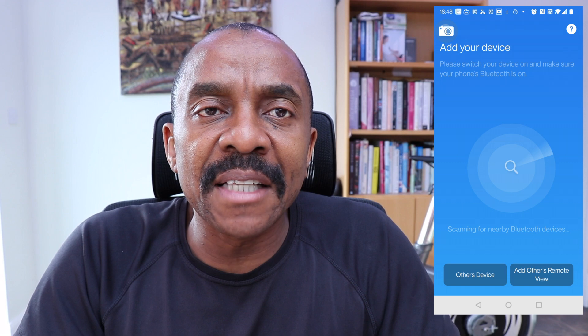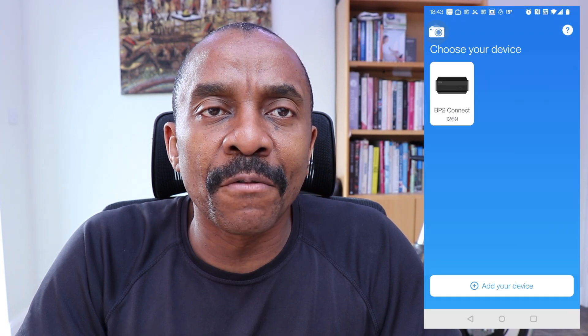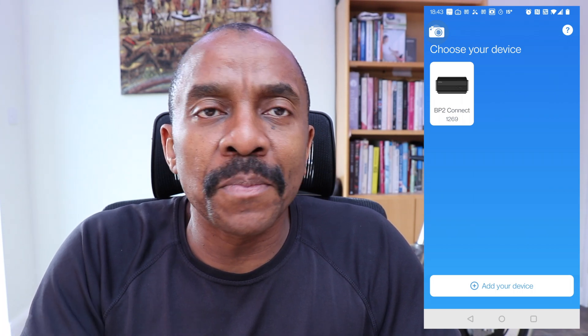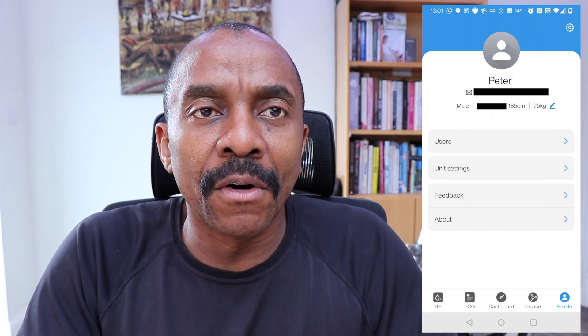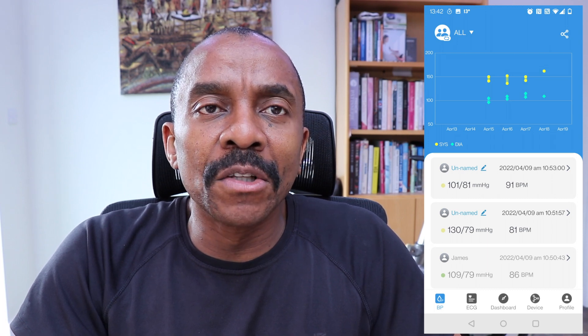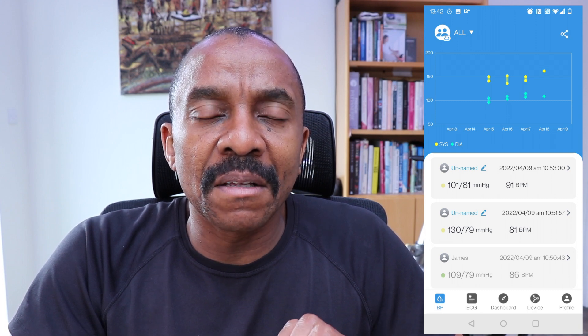Let's take a quick look at the app. When you download the app and start it, it scans for supported devices and you see an interface like this. Once it's found the device, it would show up on the display as shown, and then you can register your first user for this particular blood pressure monitor. Once you tap on the supported device, you would have an interface that looks like this, where you would see all the blood pressure readings for everybody that has used this particular device.